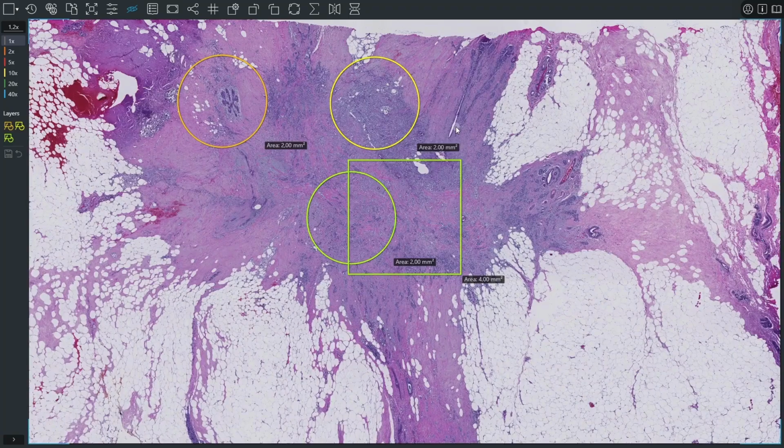A set of measurements and annotations placed on an image can be saved as a layer. To save one or more measurements and annotations as a layer, click the Save Layer icon in the Layers section of the vertical toolbar. All saved layers will appear in the Layers section and will be identified by different colors.